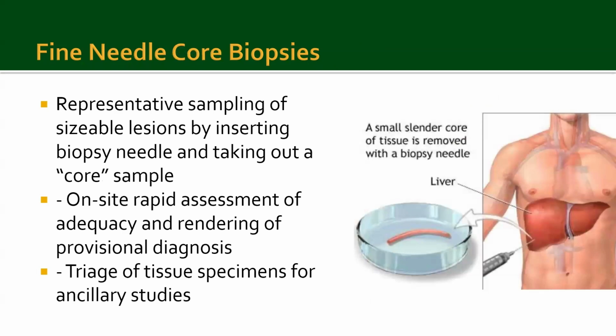So, fine needle core biopsies do representative sampling of lesions. They insert a biopsy needle and take out what is basically an elongated piece of tissue.